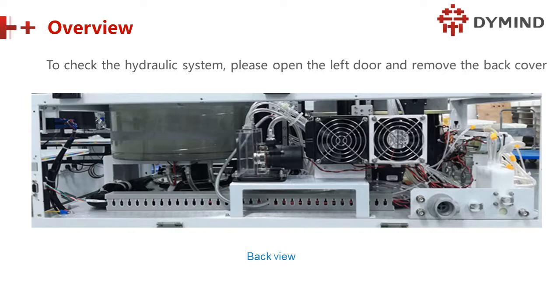So for the hydraulic system, once there's some liquid moving, we call it hydraulic. And we should know where it moves. We should know the direction. Is it running this way or that way? What's the name of each part? How can I do troubleshooting? And what's the principle of each hydraulic part? So we should know these things.